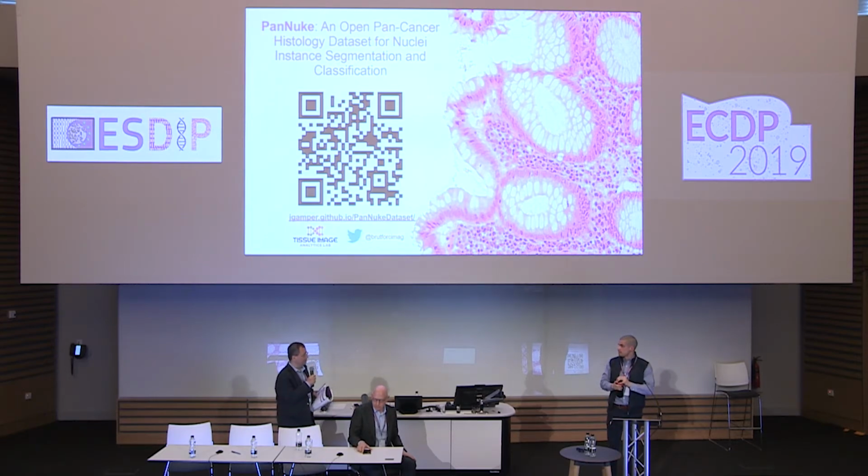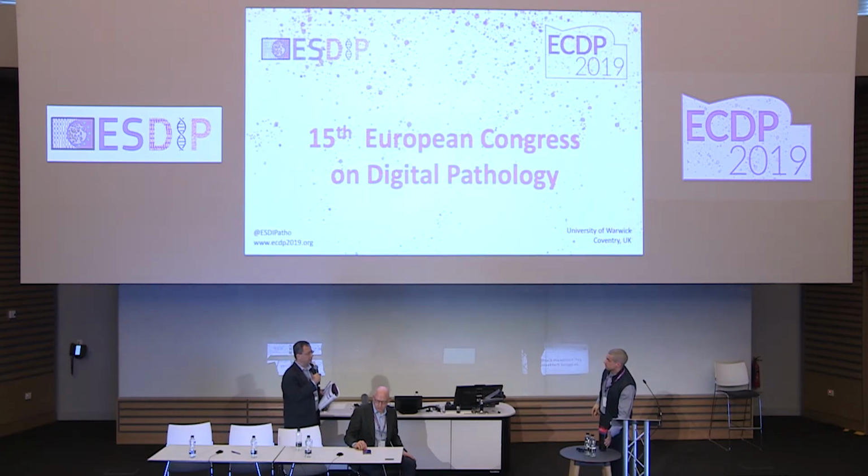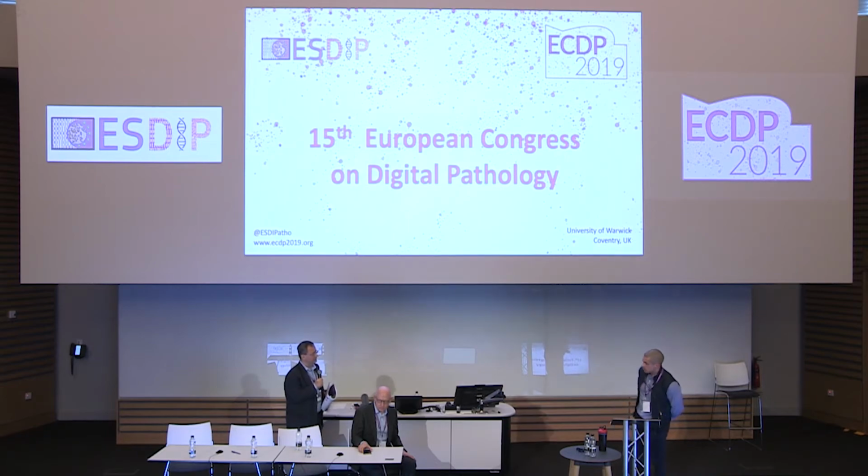You said that, if I understood correctly, you try to avoid the areas of artifact, right, when you create this ground truth? No, it's the opposite. We try to include them. Okay. We try to mimic the real environment that the algorithm might work in as much as possible. Can you explain the reasoning for that, just the importance of it? So the importance of it is the concept of sampling bias. We want our data set to be representative of the population of all the possible examples that we might face in pathology imaging.